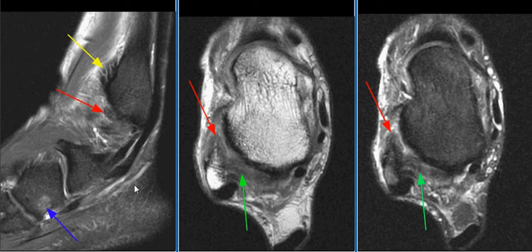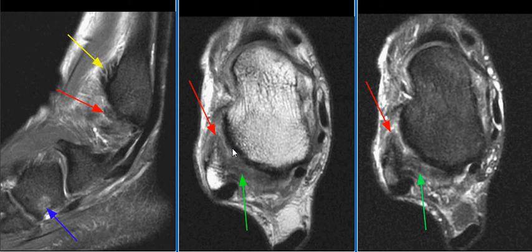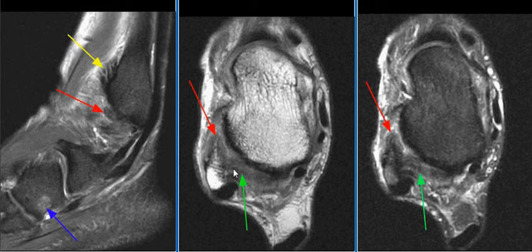We have an MRI examination of the right ankle. There is a complete tear of the anterior talofibular ligament, as seen with red arrows on these images. There is a high-grade sprain of the posterior talofibular ligament, as seen on these images with green arrows.